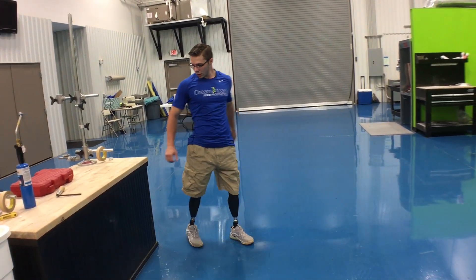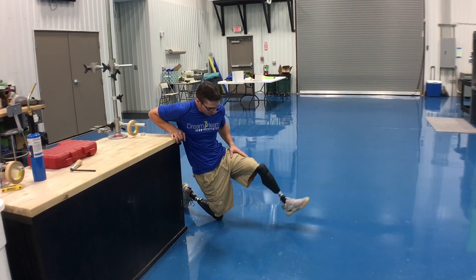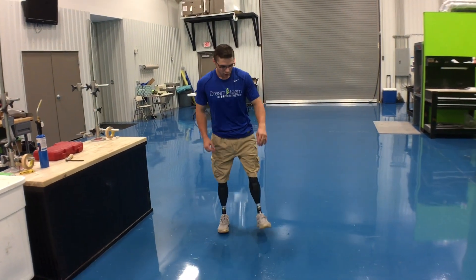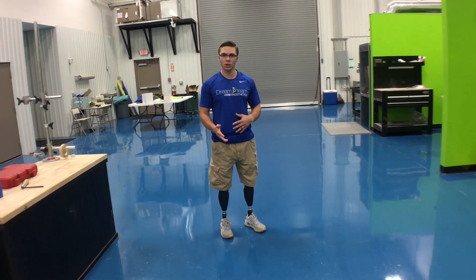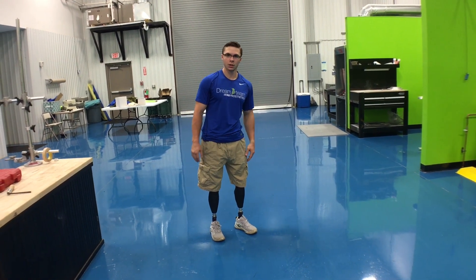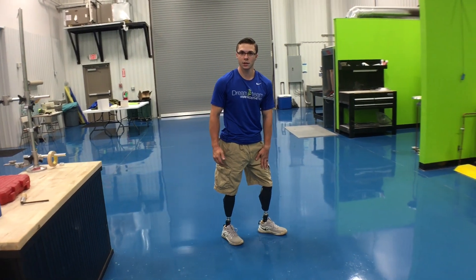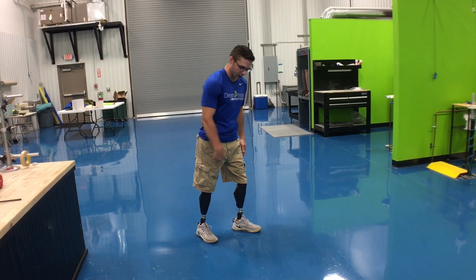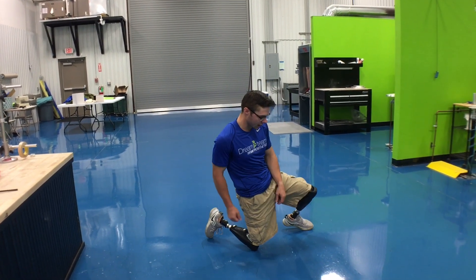Let me show you that again in real-time motion — just like that. For the more advanced technique, going down is the same. I ride that resistance down with the left leg because it is stronger, and I bend the right leg to take the impact, just like that.